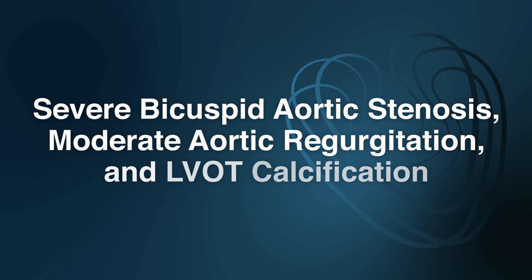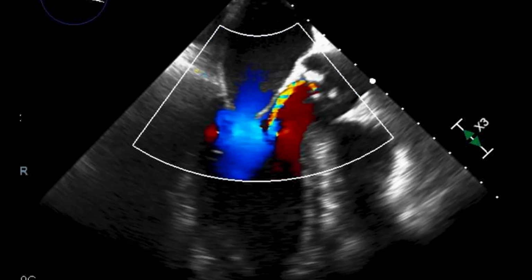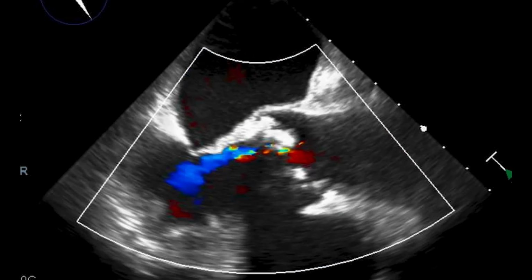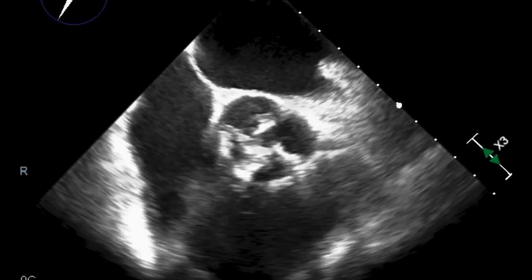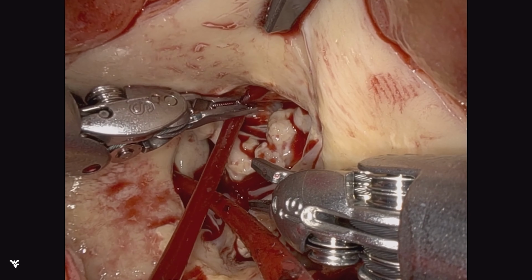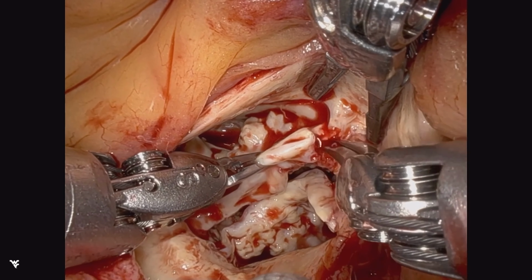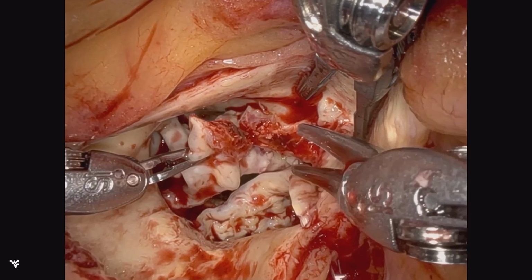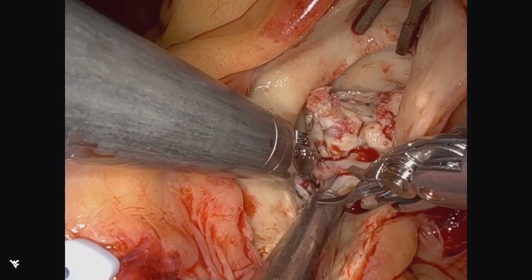Now for a case that's even more calcific, with this heavy burden of calcium, the patient has aortic stenosis plus eccentric regurgitation. The calcium score was exceedingly high on CT scan, and we were not able to arrest antegrade only, so we had open and now arrest through the coronary ostia. And here we have another heavy burden of calcium. So we're working on resection.